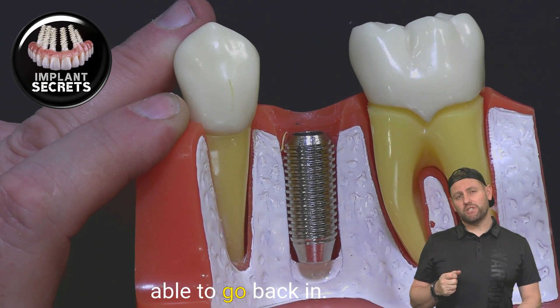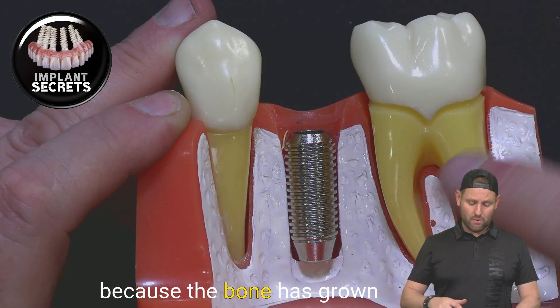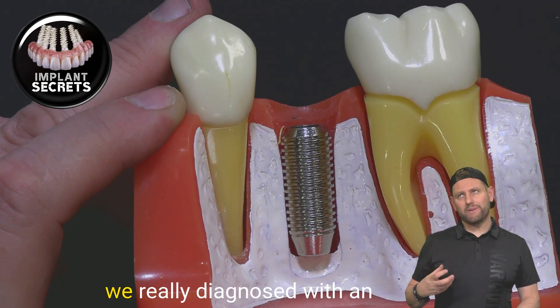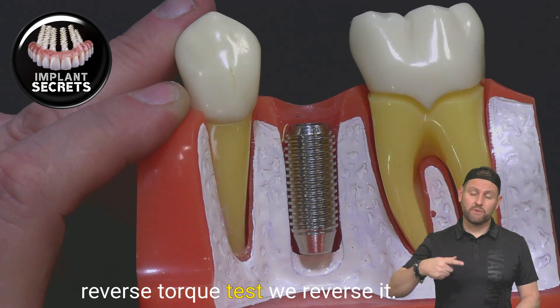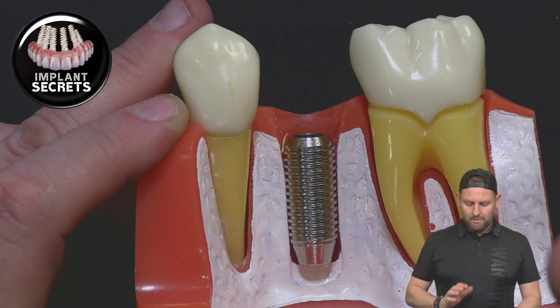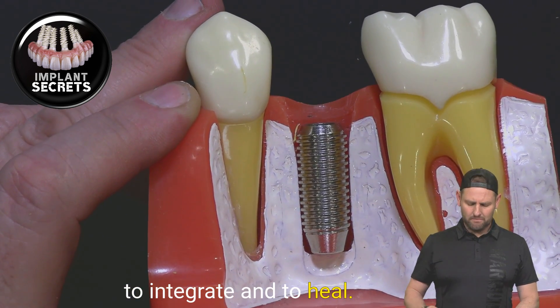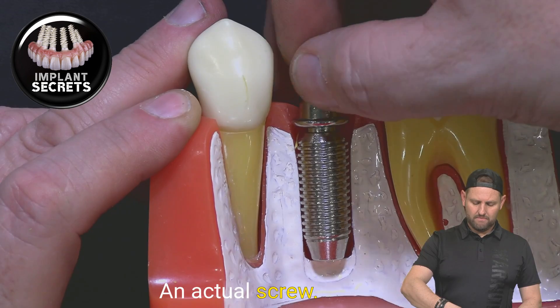So if the doctor tried to go back in and reverse it, it actually wouldn't reverse out because the bone has grown into all those tiny areas — which you can't really see here, but you can see it on the x-ray. That's one of the ways we diagnose whether an implant has completely healed. We call it a reverse torque test — we reverse it, put a little bit of pressure, and if the implant doesn't move, we know it's a healed implant. So the implant goes in, a period of time passes for the implant to integrate and heal, and then we put an actual screw in it.